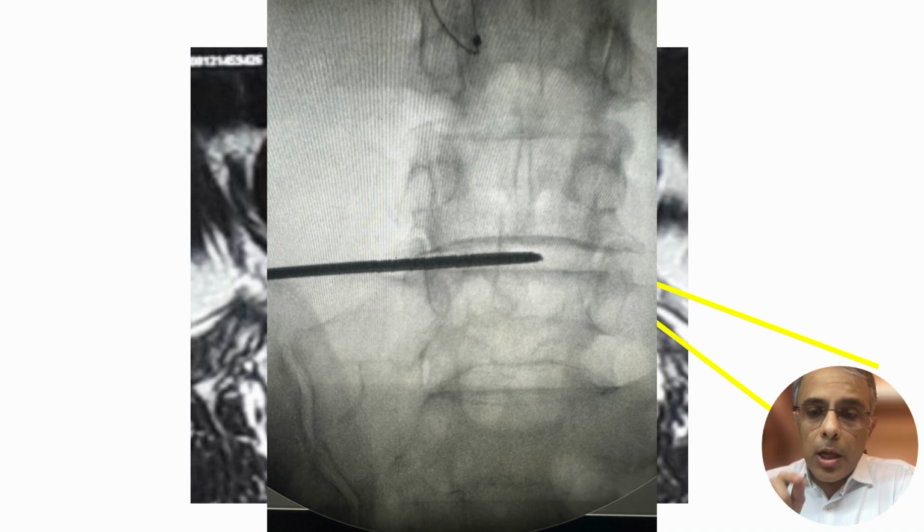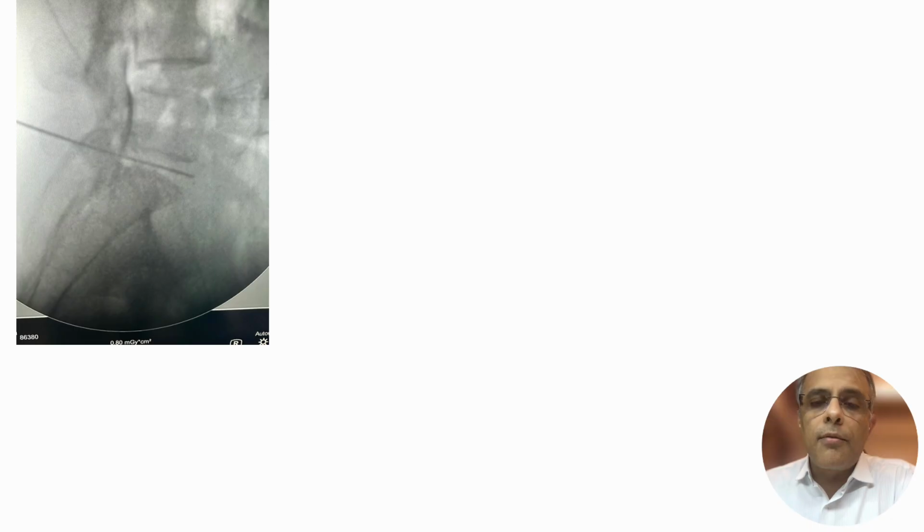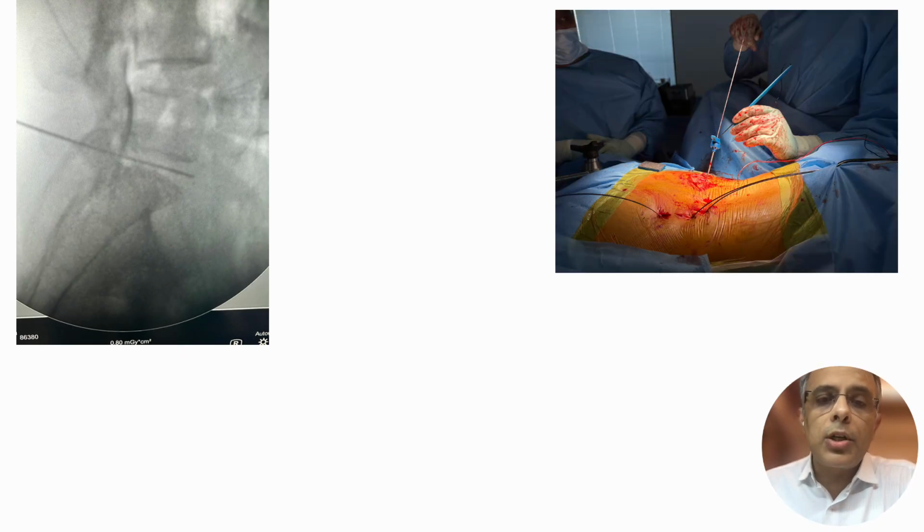This is the particular case wherein there is this oval kind of vertebral body, and you can see if your needle is crossing just midline and approaching the medial border of the pedicle, that should be enough and ideal for the position. Now while doing that, you can slightly do an orthogonal maneuver in reverse direction so that you can achieve better obliquity. So this is now the guide wire which is inserted inside.